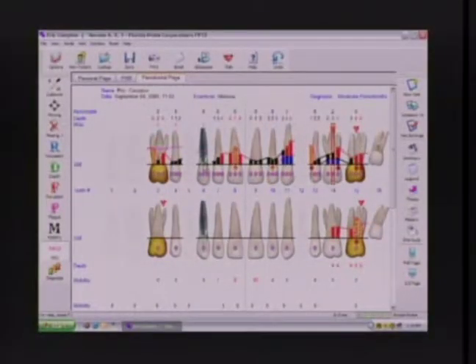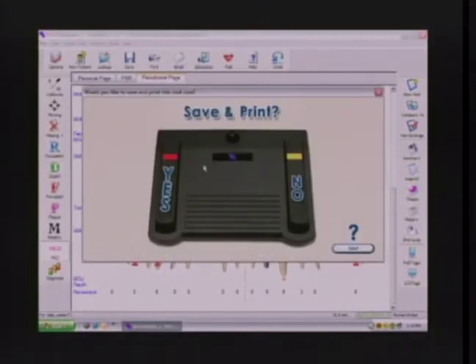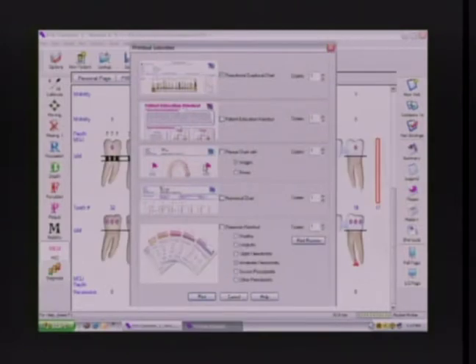So do you have any questions about the MGJ mode? No. Okay, well, let's advance through. Lower arch. Now at the end of the MGJ mode, and there is a lingual aspect on the lower arch, I pause. Am I confident? I advance. Data collection complete. This time, is the exam complete? Yes, we've done all the modes. So I say yes. It's now saved to the database, and it's taken me to my print options.